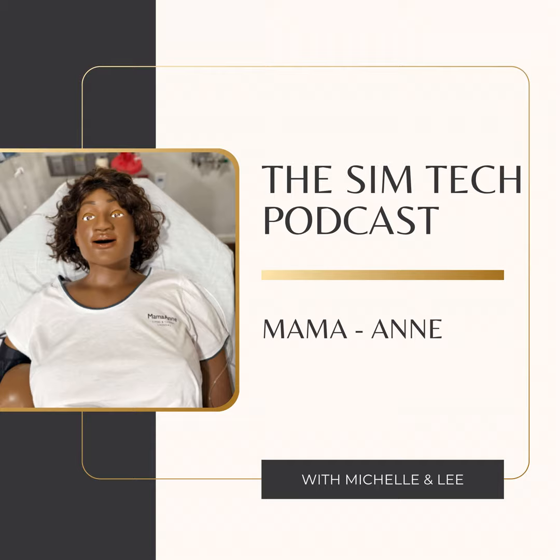And my third one, I would say, is mobility and positioning. Again, with Sim Mom, you can put her onto all fours and put her into stirrups and do McRoberts, but it's a lot more difficult because you need an extra tool set to be able to lock legs and arms, and her arms don't lock into place. So with Mama Anne, you can lock her arms into place, but you don't need a tool for her to keep her leg positioned.